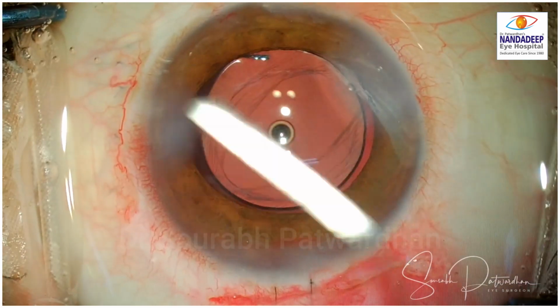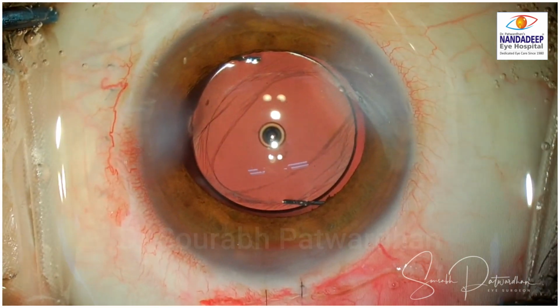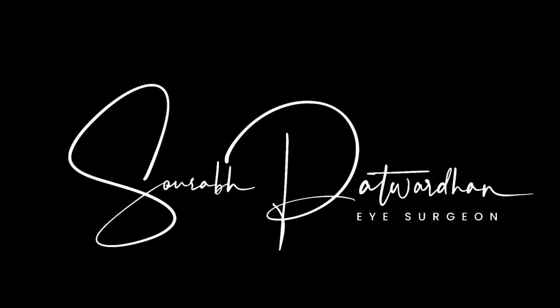You can see that the IOL is now nicely centered, and the patient did quite well. Patient got 6/6 unaided vision. The biometry was perfect. The scleral incision reduced the astigmatism by 1.5 diopter, giving a perfect post-operative result.